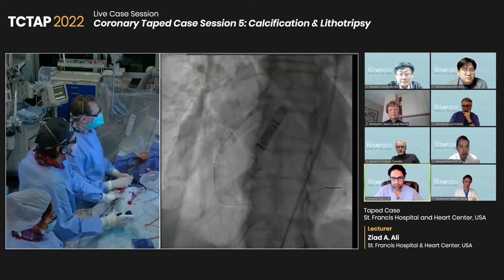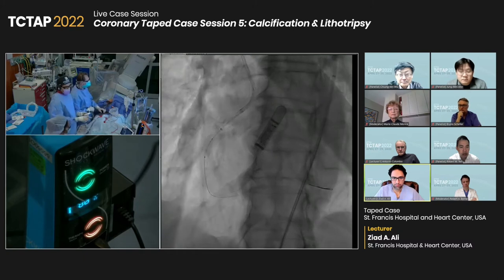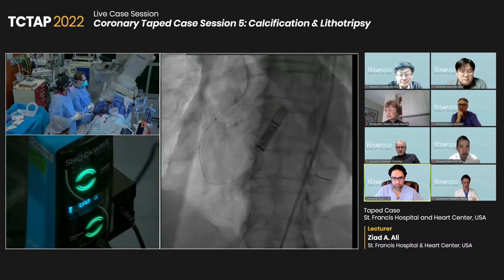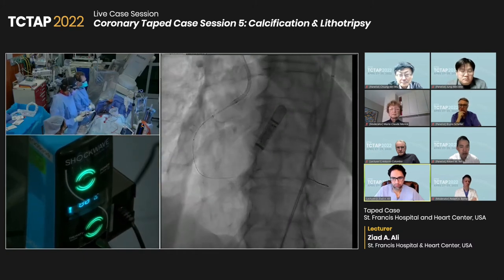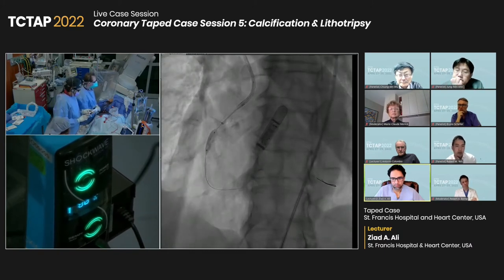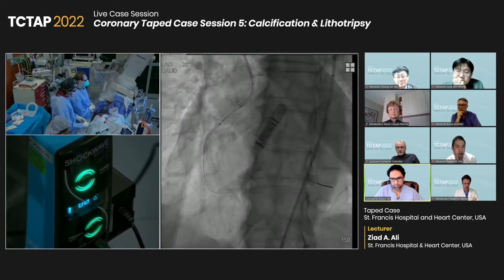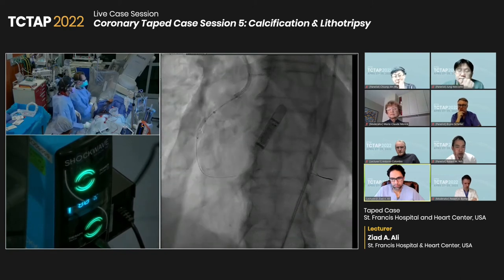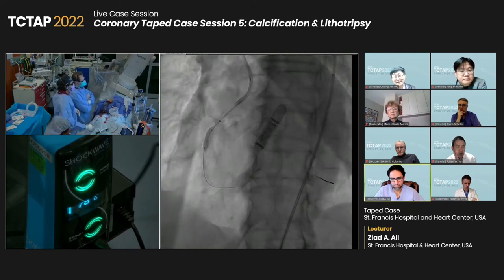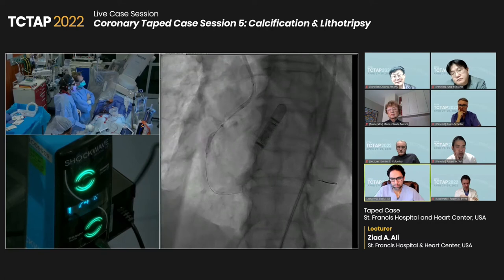So you want to talk about the emitters? Yeah, the emitters are inside the dots, right? Yep, so go ahead and press therapy. There are two emitters. The first emitter is 6 millimeters proximal to the distal marker. Okay, so I'm up at 4, and we're going to start delivering shocks. Off fluoro, please, Alan. On fluoro. You can see the dog bone nicely here. It looks like it's opening. Opening, yeah. Wow.